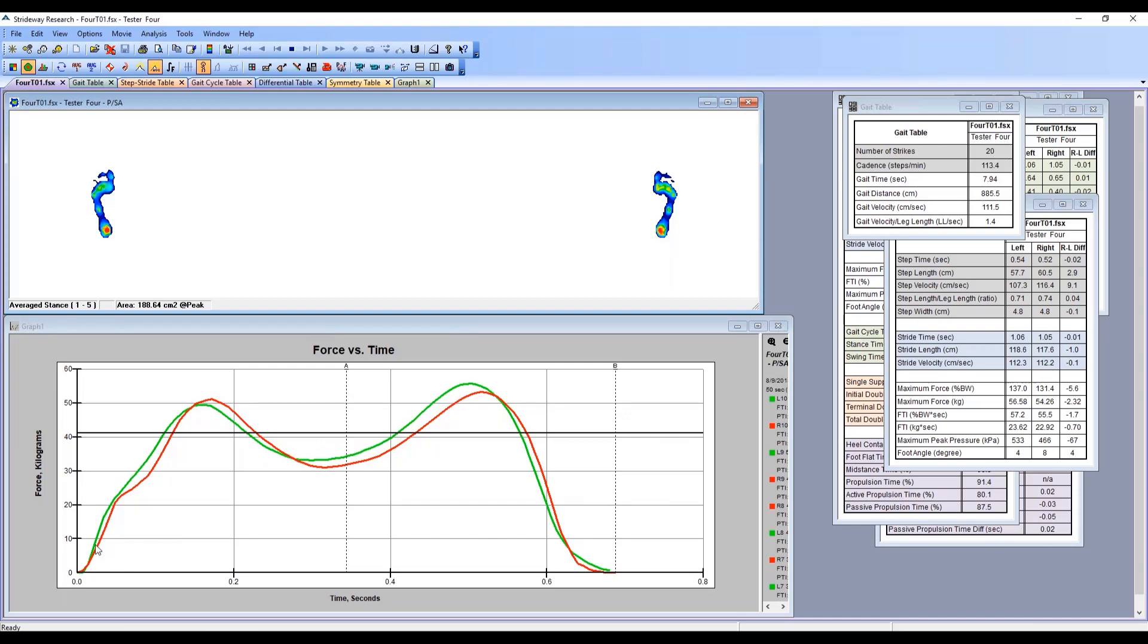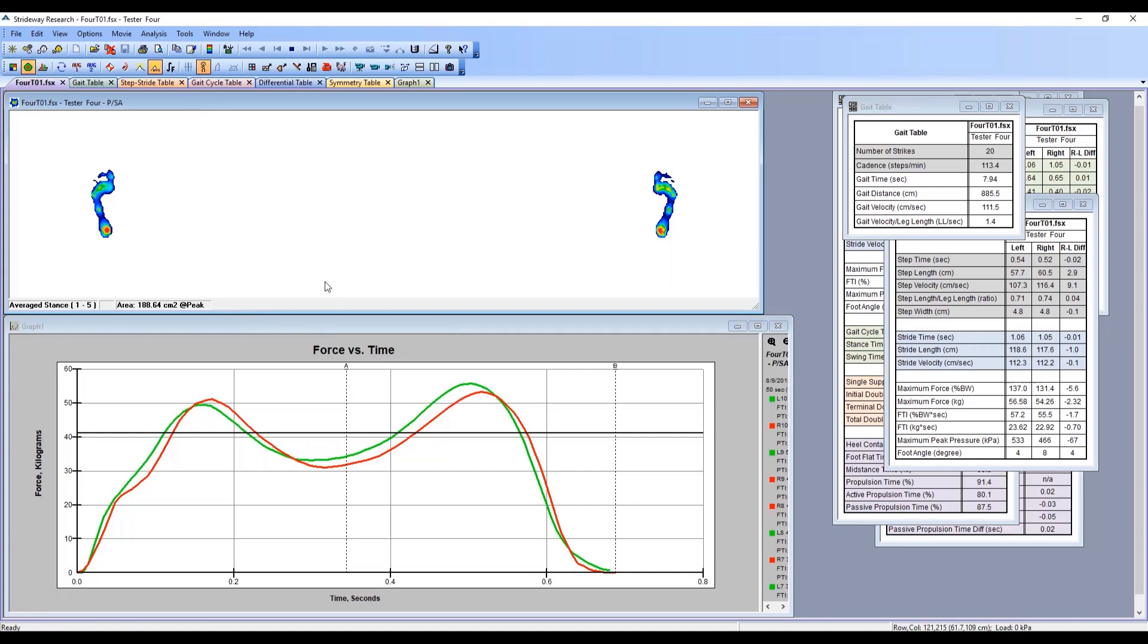This makes it a little bit easier to now look at the force time curves and look at what kind of differences there are in the heel pivot phase, the mid stance phase, and then our active propulsion phase here. It just makes it easier to really understand where the asymmetries are.